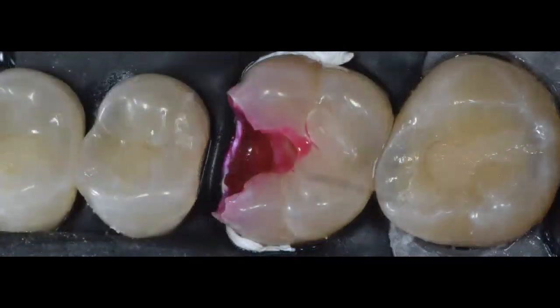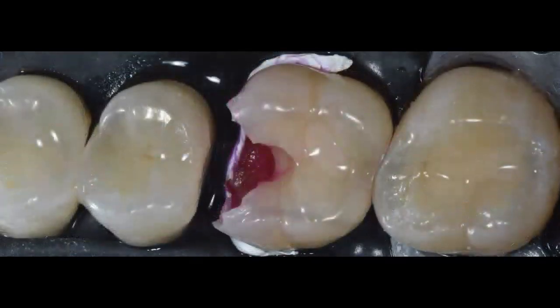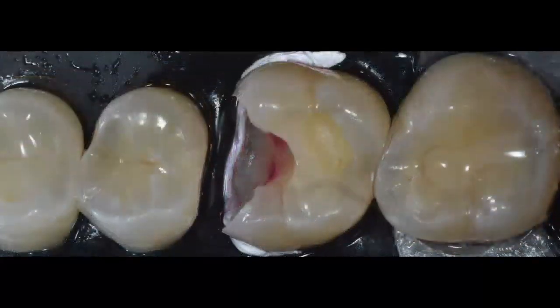So by keeping that Teflon in place, you can see now I'm applying my caries detection dye. That's going to allow me to visualize where that staining is and where that soft caries is, and now it allows me to clean. You can see that I've been able to clean that little bit of enamel left on that deep box, but most importantly, that dentin and that DEJ, because I want to make sure that I have a nice and clean caries-free peripheral seal zone, which is approximately 2 millimeters from the DEJ on that proximal box, 2 millimeters axial. So you can see here, I've been able to accomplish a very nice and clean peripheral seal zone.